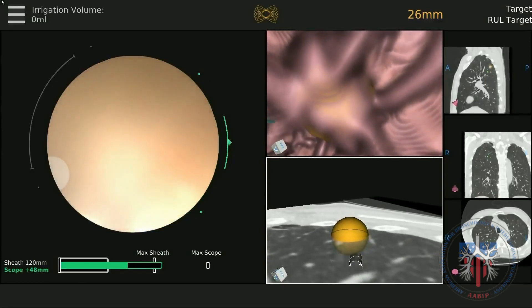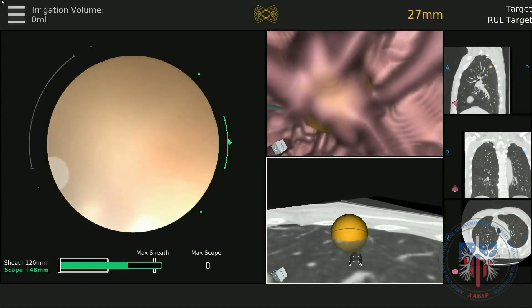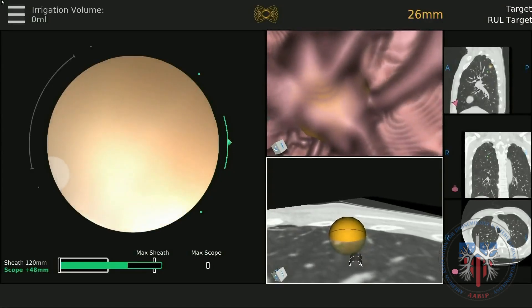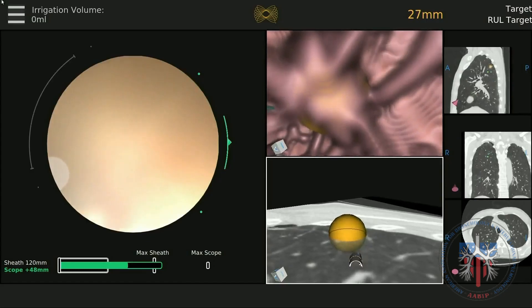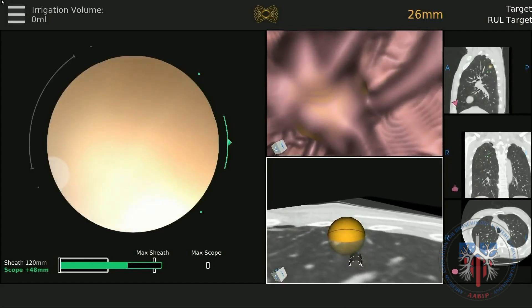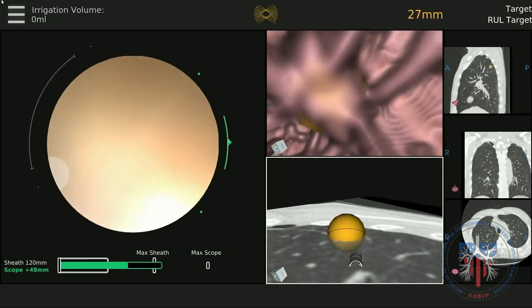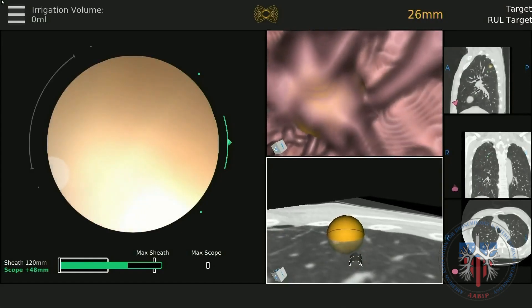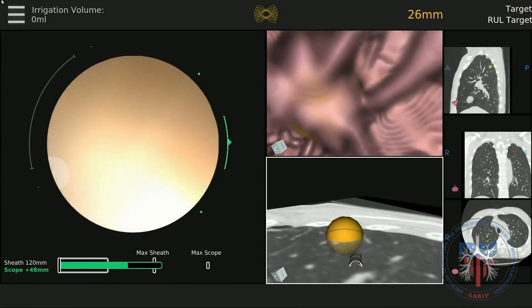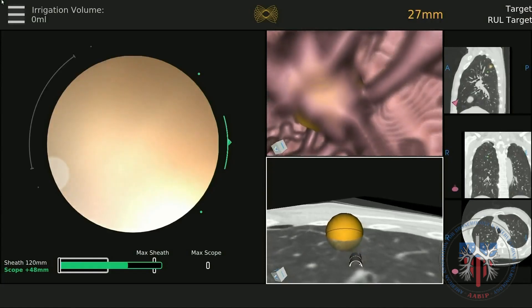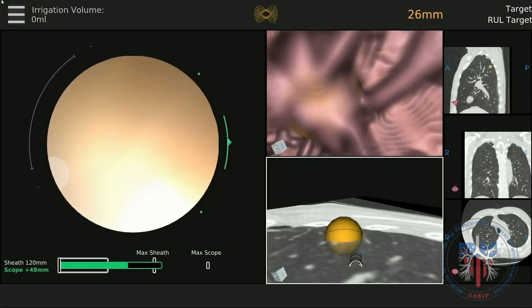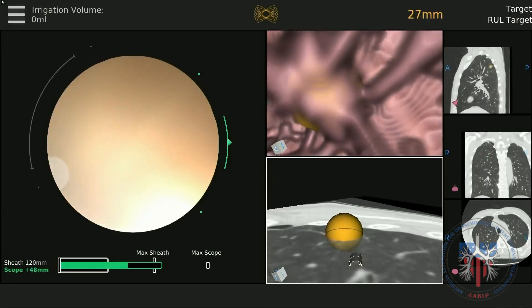After approaching to within 30 mm of the target, you can toggle between imaging screens to ensure that the scope is oriented in a direction that can access the lesion. Radial EBUS is often used at this time to confirm position. After aligning the target in a satisfactory position, hit the button at the top right — the play/pause button — and navigation is now complete.